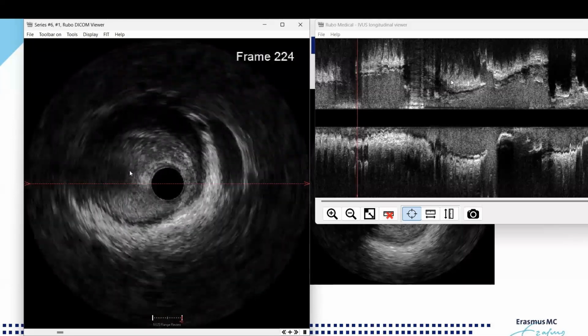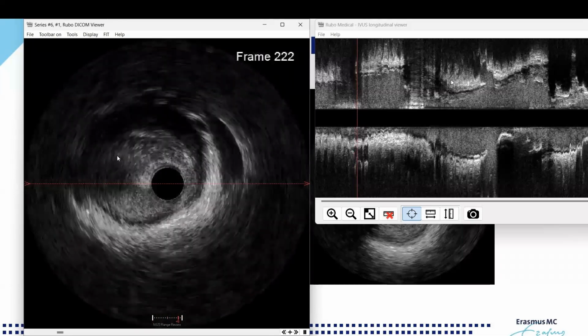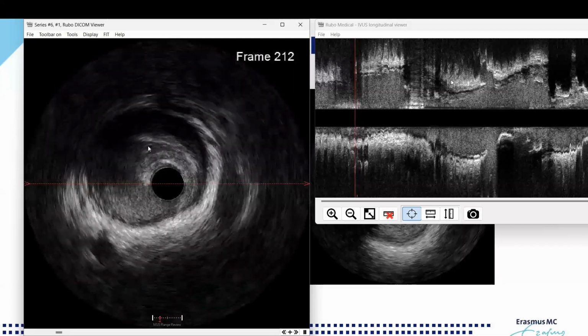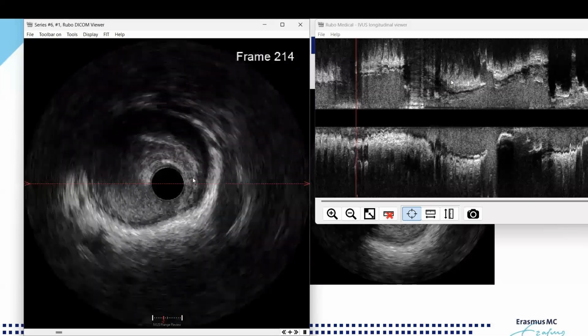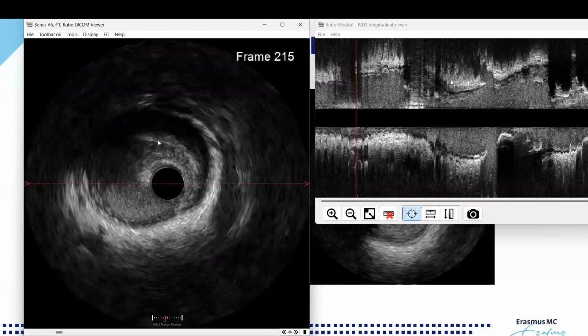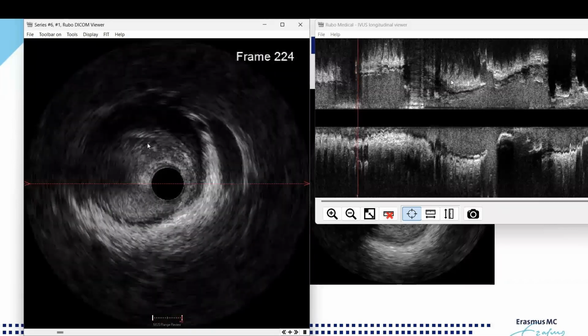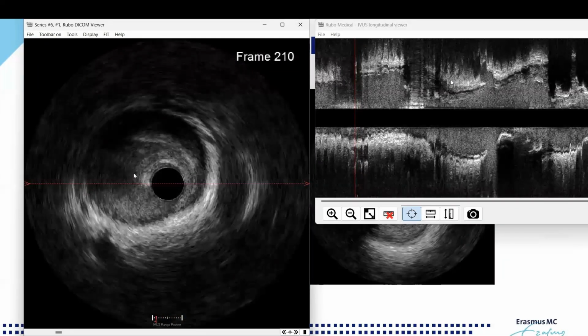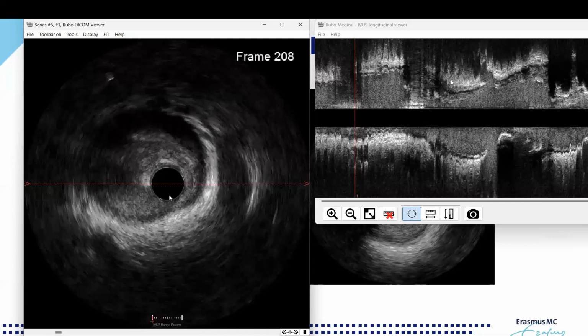Thrombus is another subject for a course in there. But what you see here, thrombus is always on some point against the wall. Yeah, and I see here on the wall, I see some thrombus attached to the wall, and actually compromising a bit the lumen.